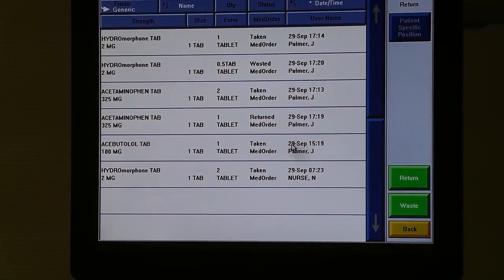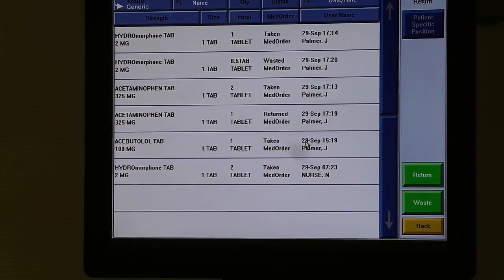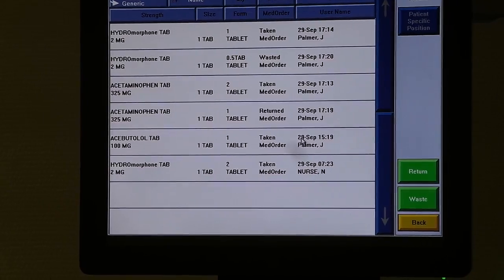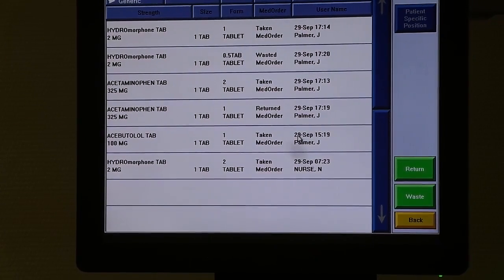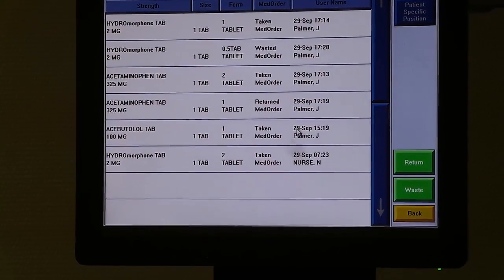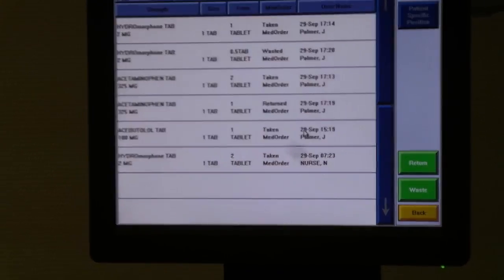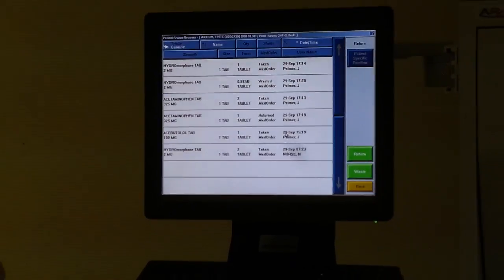Note that the return drawer did not open for waste. All waste should go in the blue and white SharpSmart containers.